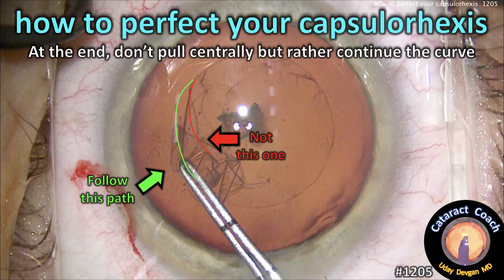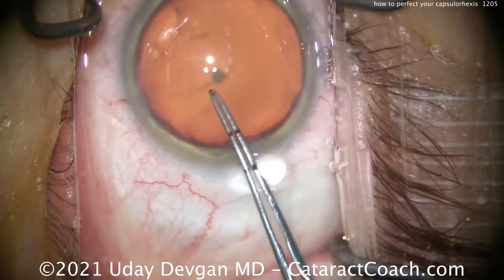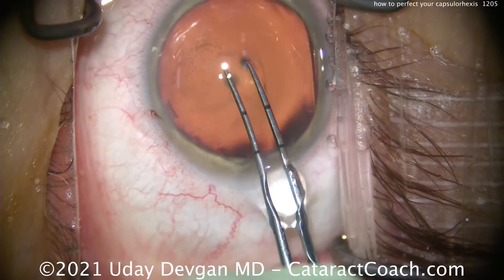CataractCoach.com: how to perfect your capsulorrhexis. At the end, don't pull centrally but rather continue the curve. Let me show you what I mean here.